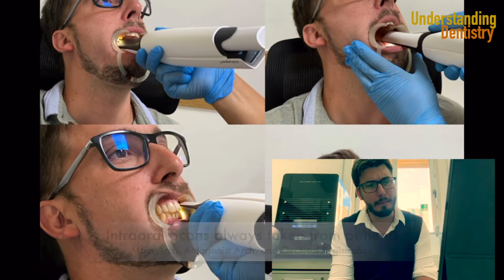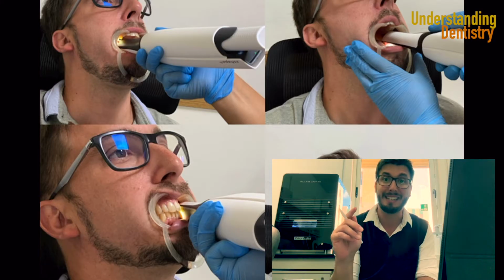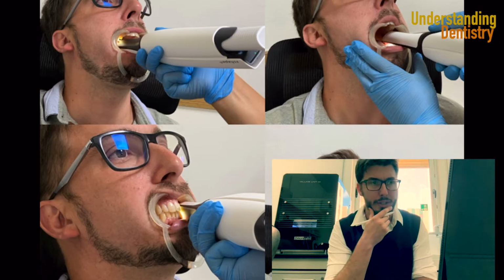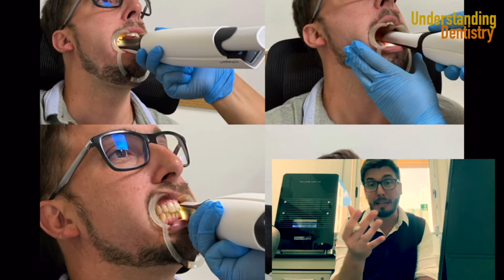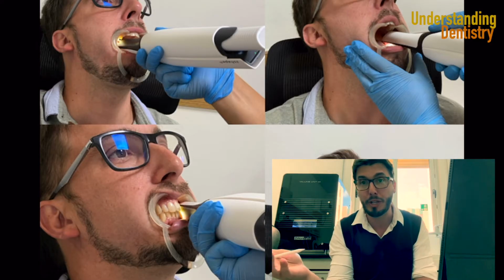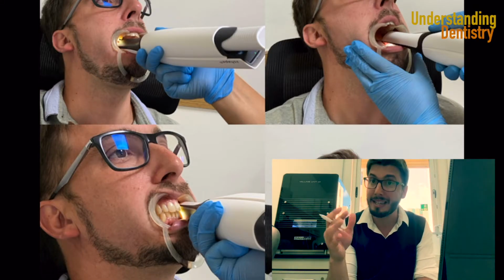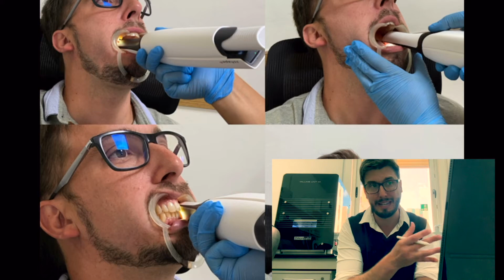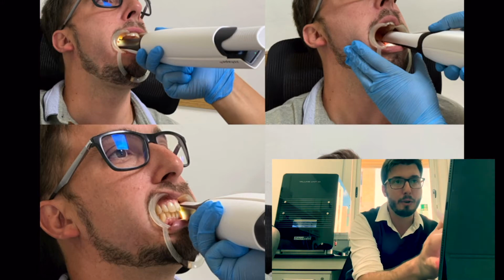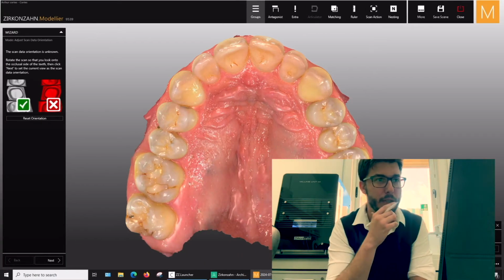We already commented about intraoral scanning techniques in previous videos, including the one on detecting caries using the intraoral scanner. I'm going to add the link here on the top right corner of this screen. And basically you need 4 intraoral scans: the upper, the lower, and then the bite registration, which could be 1 or 2 scans, depending on the case and depending on the system that you are using. That's the Trios from 3Shape, but the Trios 5, but of course it depends. So that was actually the Trios 4, but I used the Trios 5 in this procedure.